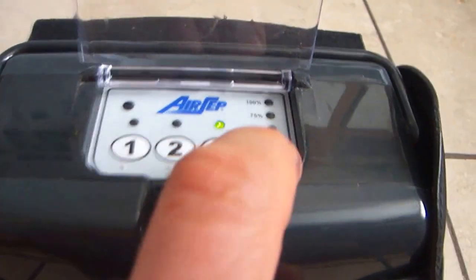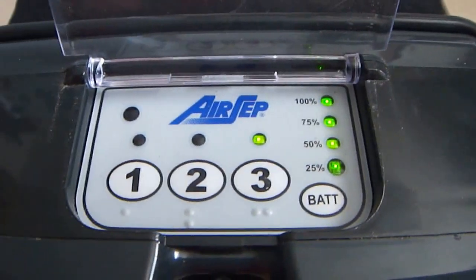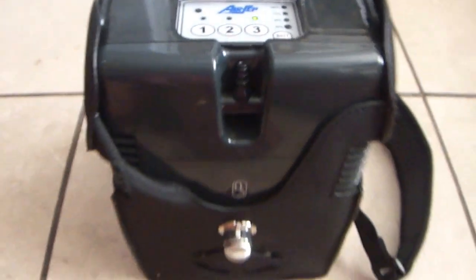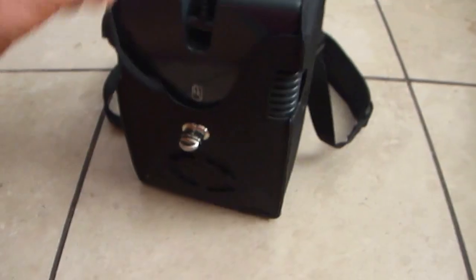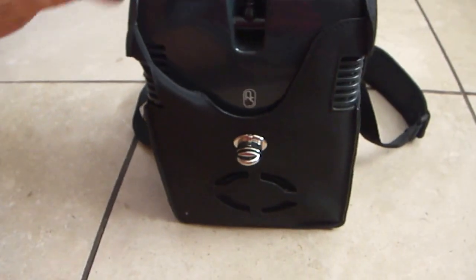Check battery life — you just push here. The battery is good. Nice effect on your travel.